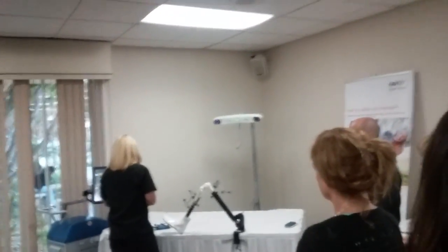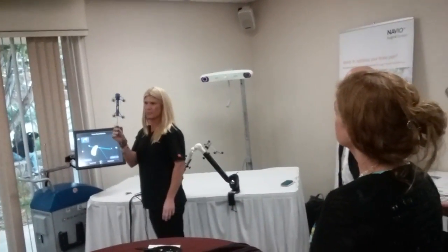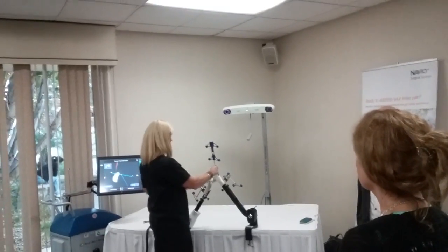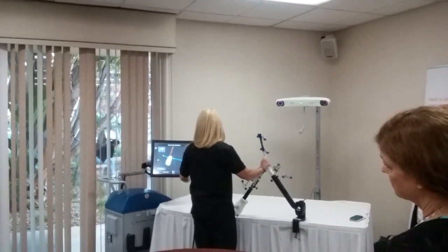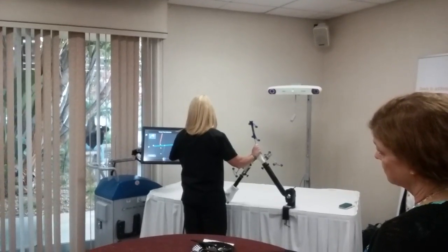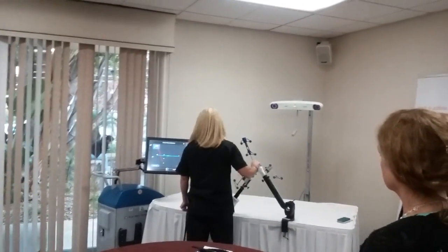And then when we come in, he's going to actually use this device. This is the Point Pro. This collects all the data. And it has to show up to the camera. And you can see it on the screen here, my Point Pro. And if I take away a few of my points, they're gone. What I have here is a couple spots that the surgeon has taken on the patient's anatomy.